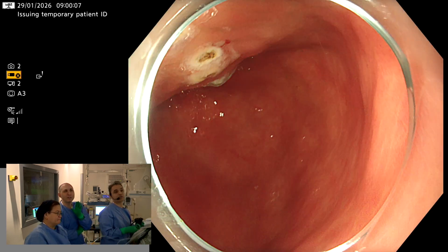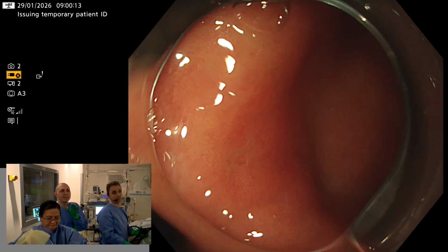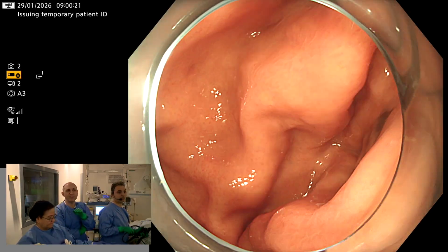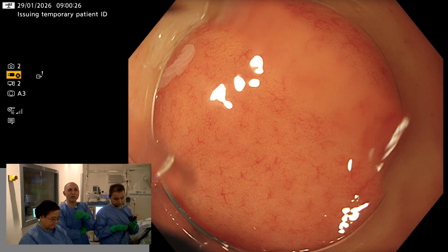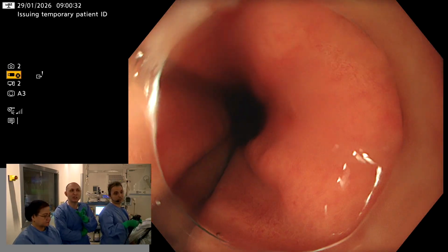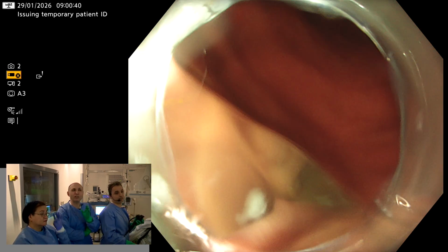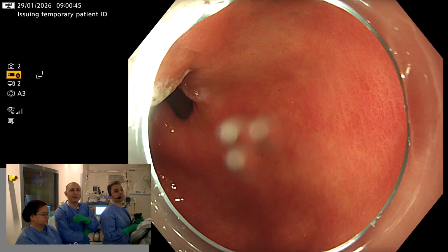If you could make a good characterization with the endoscope, and you have the feeling it is malignant or potentially malignant or benign lesion, as long as it's a mucosal lesion, sometimes the biopsy is not mandatory in ESD. And by the learning curve of doing this characterization and assessment, you could judge which lesion will need biopsy or is suspected of deep invasion, or which lesion will be superficial and convenient for the ESD.